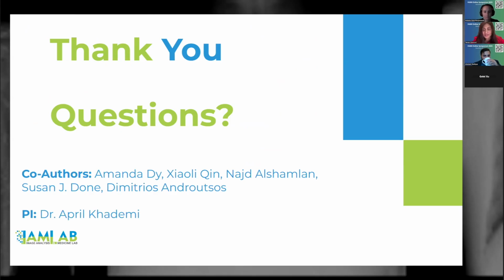It says, do you have any insights into why some models are more robust than others? I think it was all in the training strategy. Some use good data augmentation strategies, and they use very diverse data from different scanners. So I think this is one of the reasons that some models were doing well and the others were not.